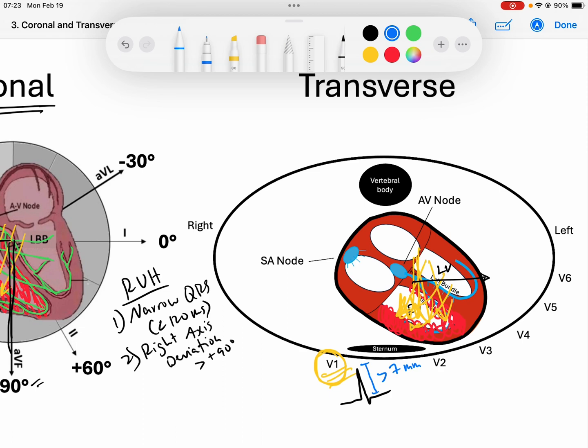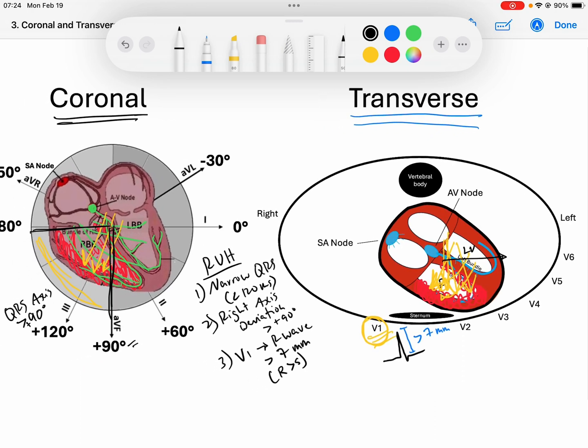That is my criteria from my precordial leads for right ventricular hypertrophy. V1, the R wave will be greater than 7 millimeters. There are some other criteria that people use. You could also have in V1 the ratio where the R wave is greater than the S wave, meaning the positive forces are greater than the negative forces. Sometimes people will say there will be a dominant S wave in V5 or V6. However, I'm not really a huge fan of that one.